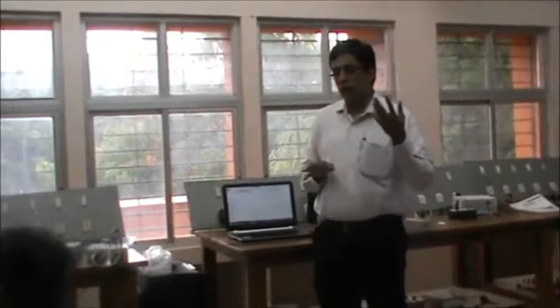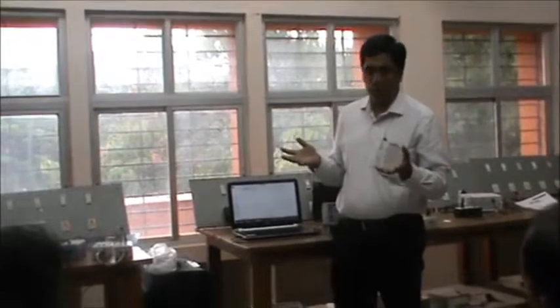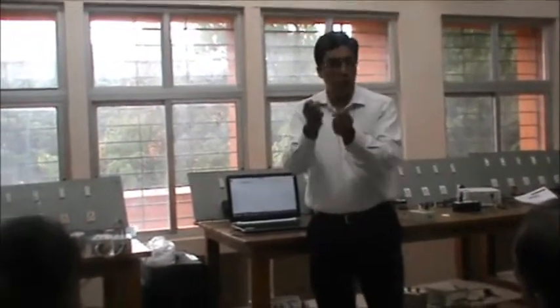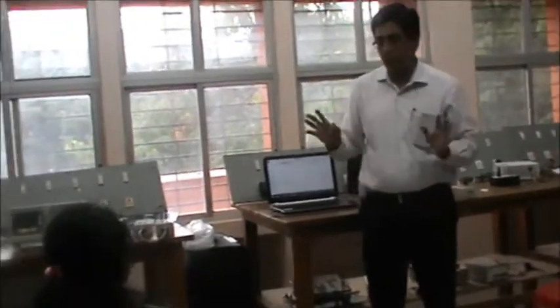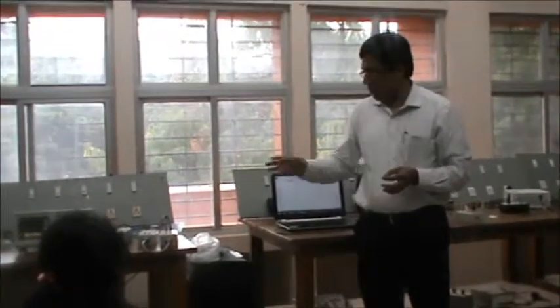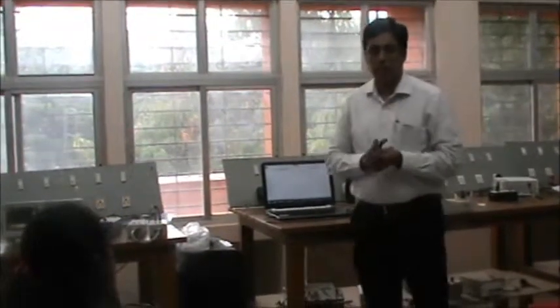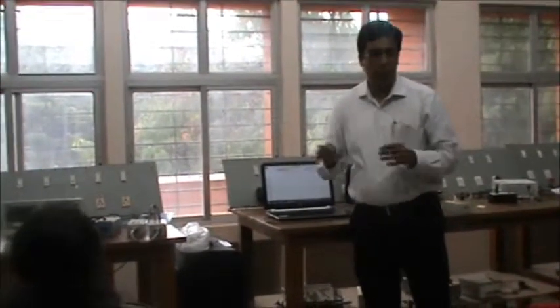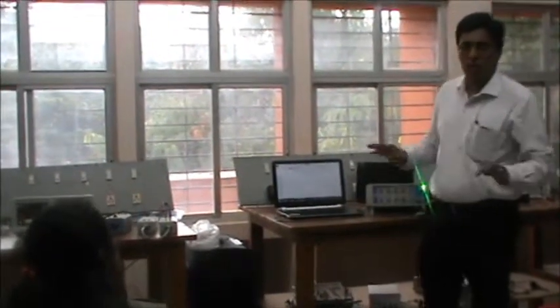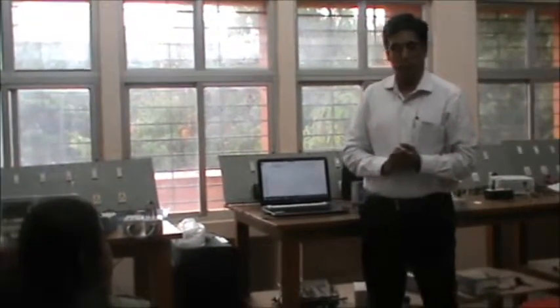If you talk about a patient monitoring system in a hospital, normally it will have 3, 4 parameters or 5 parameters at the most. But then there is a limitation: you cannot acquire the digital data from any patient monitoring system. That is unfortunately not available practically. So that was the reason why we thought of having this kind of educational setup wherein you can connect any amplifier. It is not dedicated that channel 1 is for ECG, channel 2 for something else. Any signal can be connected to any channel and you can do the analysis.